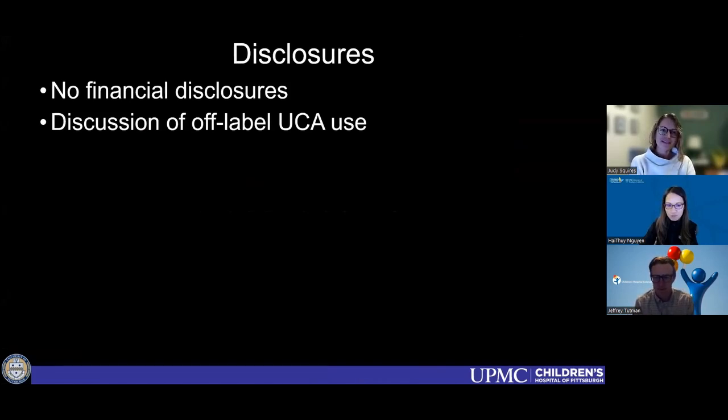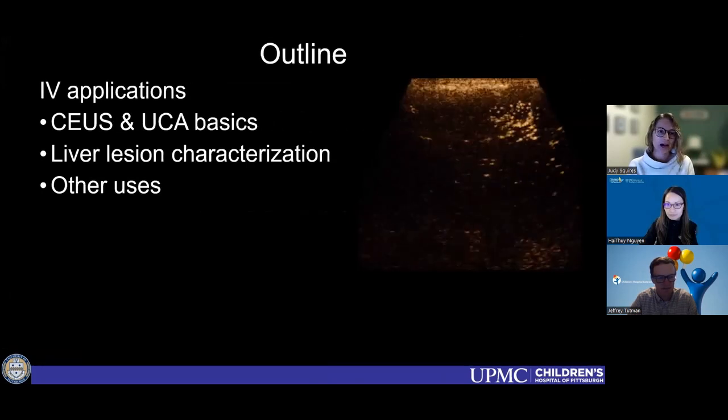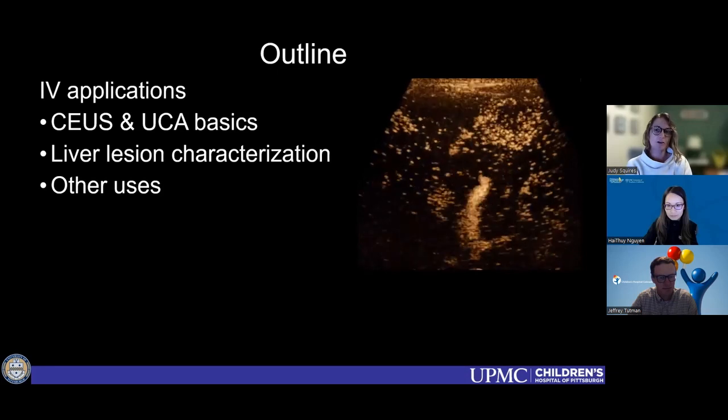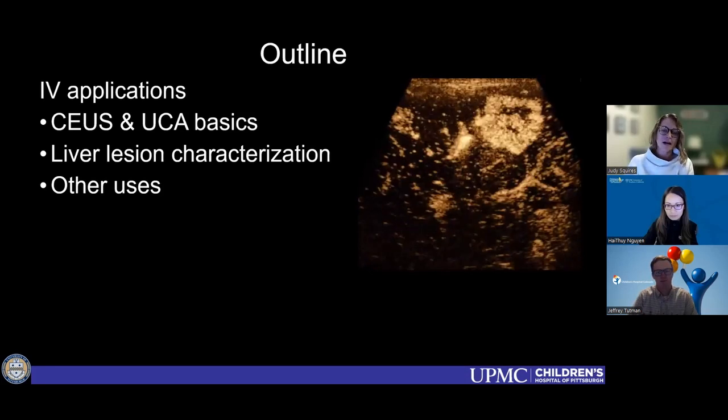The other disclosure is that at almost all of these talks, they talk about how they're going to discuss off-label uses of ultrasound contrast agents. I guess that's important, but we do so much in pediatric radiology that is off-label that I'm just going to stop saying that one of these days. But we are going to talk about IV applications of contrast enhanced ultrasound, if that's okay.